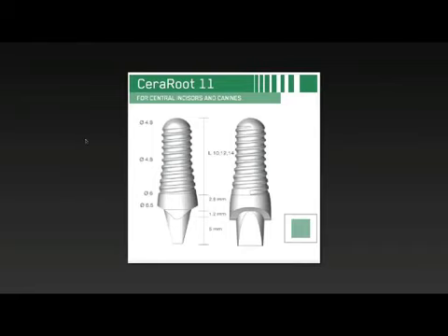Angulation is an issue for some clinicians. If we're placing these implants in sites that are augmented or sites that are ideal, angulation is really a non-issue. If we're a little bit off, just like a tooth, we can always prepare it.